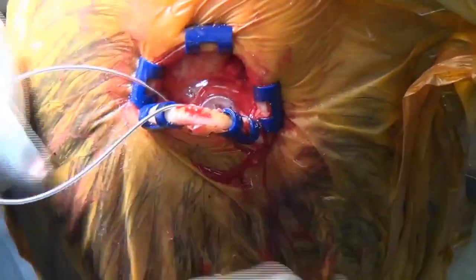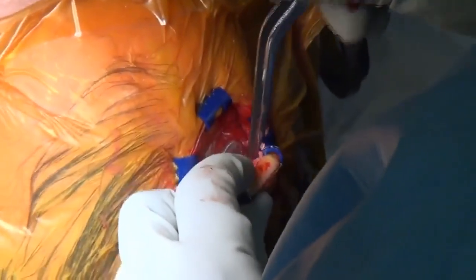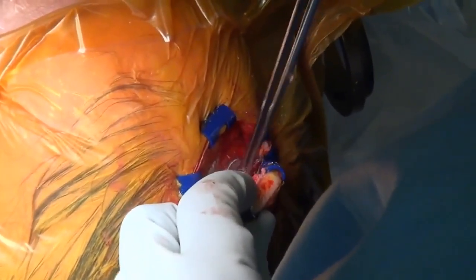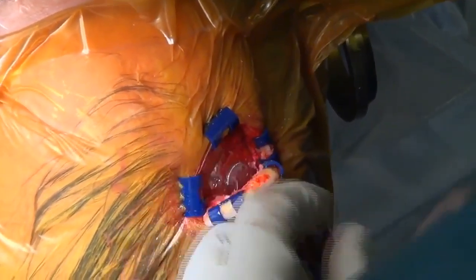It feels pretty good there. Okay. And now I tuck the redundant wire deep to this. And then we'll use the big blue wrench screwdriver to final tighten our little stim lock. Okay, looks good.